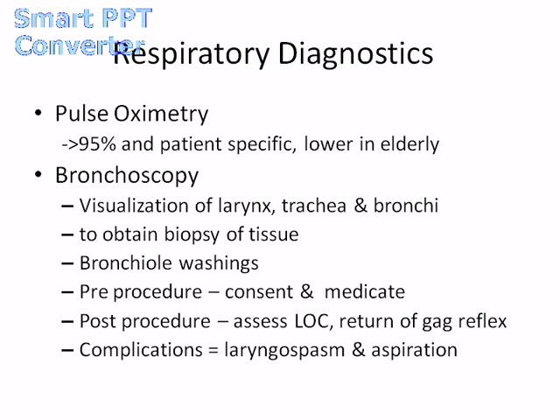Pulse oximetry to begin with, we're all very familiar with that. You guys do a great job. It's non-invasive and it checks the oxygen saturation of the blood, but it is not a replacement for ABGs. You're going to use this as a quick indicator for situations where your patient's respiratory status needs to be monitored. And it can also be done continuously, and we know that we do that whenever we are doing conscious sedation or epidural infusion, that type of thing.